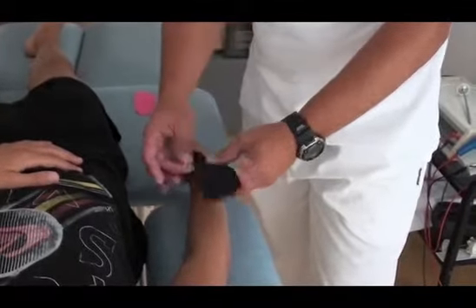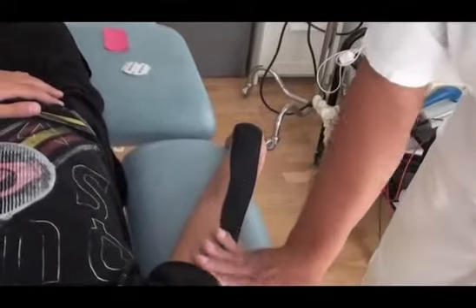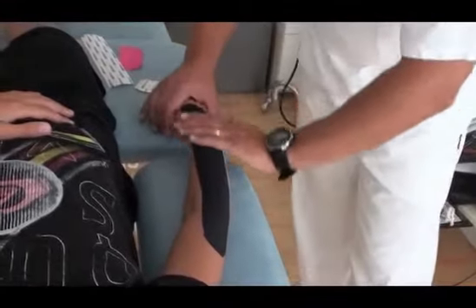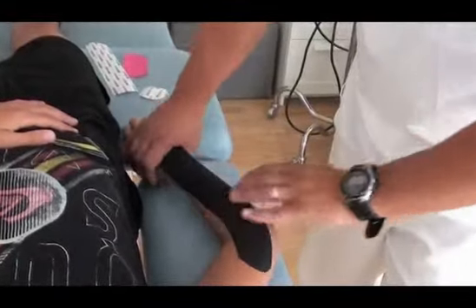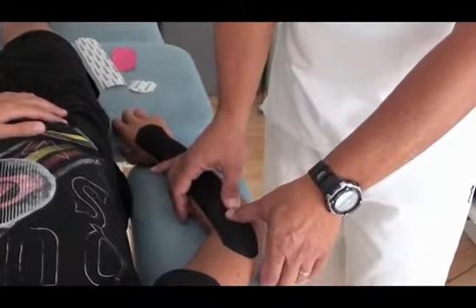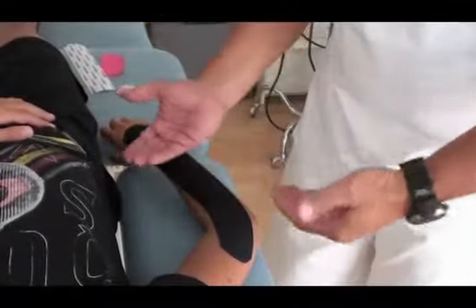Now you can pull a little bit out, then we put the wrist down, hold it down like that, and then we just roll it on. The name of the technique is muscle technique. You just roll it on and do it once or twice like this to activate the glue. When we've done this, we bend the arm a little bit. We know that his pain was when we were pressing towards the inside, but when we press outside he didn't feel any pain. That means we need the tape to pull the muscles, the fascia, towards the outside.